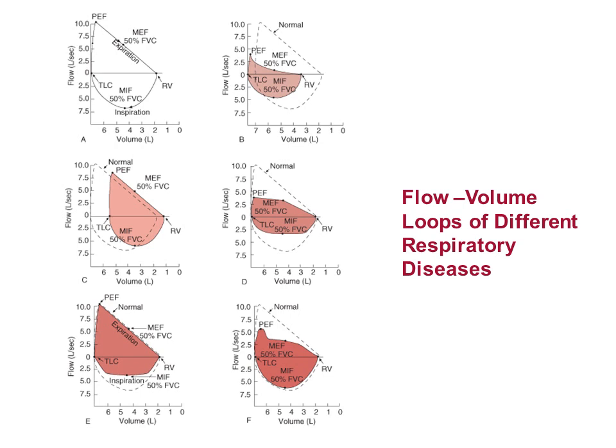Diagram B represents an obstructive case of pulmonary disease. Please note that in some obstructive diseases, such as in asthma, the residual volume will not be affected. But in other obstructive lung diseases, such as in chronic bronchitis, the residual volume can increase.